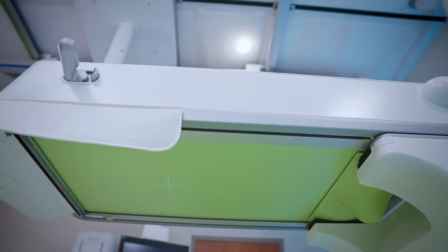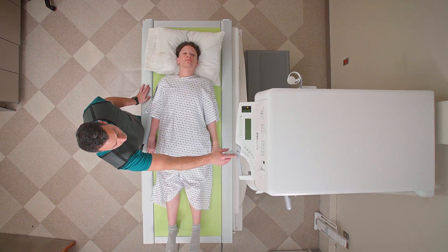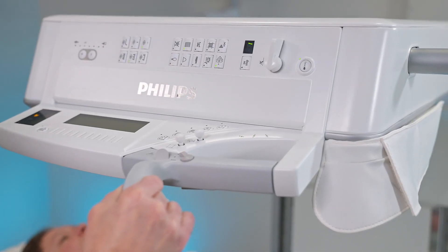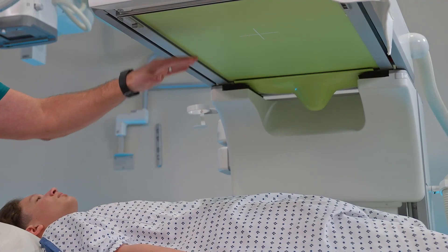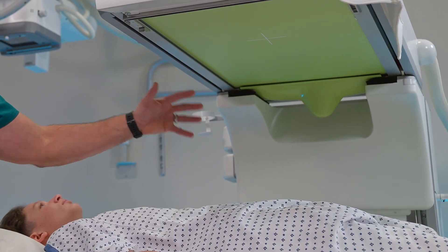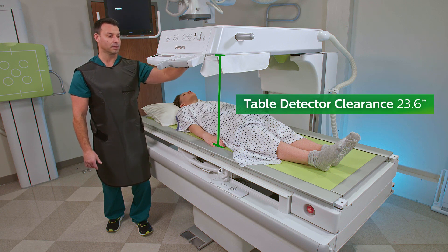I'm going to talk about the features of the tower. When you bring the tower across, push the tower — it releases a lock, and you can easily move the tower across the patient. One of the biggest new features with this system is the depth between the tabletop and the bottom of the detector. It's almost 24 inches — 23.6 inches from the tabletop to the bottom of the detector.